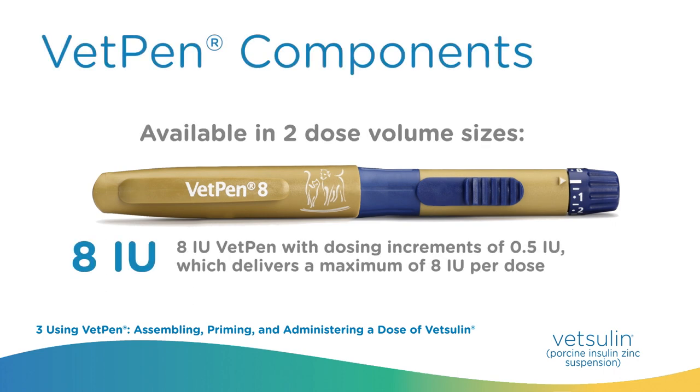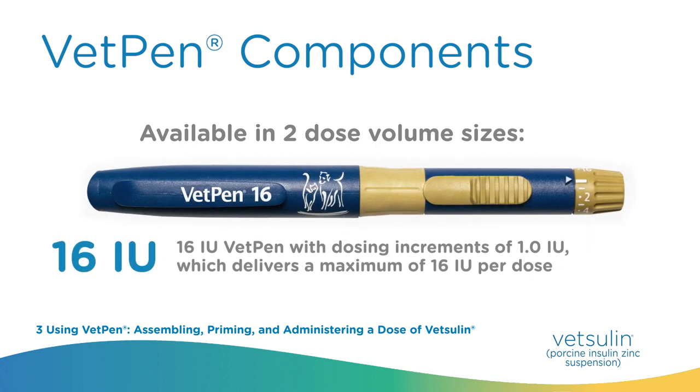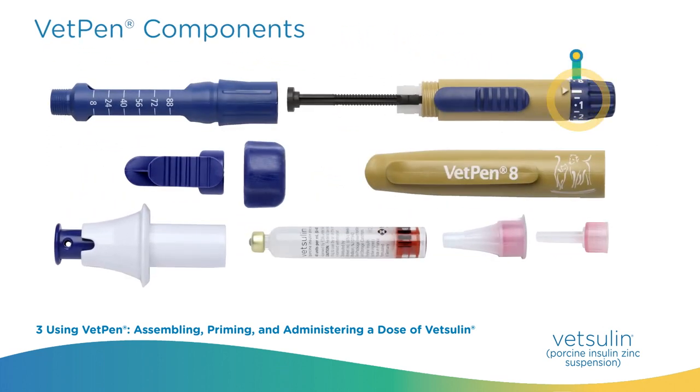VetPen is available in two versions: VetPen 8, which delivers 0.5 to 8 units in 0.5 unit increments per injection, and VetPen 16, which delivers 1 to 16 units in 1 unit increments per injection. The VetPen components are: dose selector, pen body, release button, internal plunger, cartridge holder with remaining units indicated, pen cap, 28 pen needles with needle covers and protective caps, cartridge plunger, cartridge, dose selector adapter, release button extension, and needle remover.